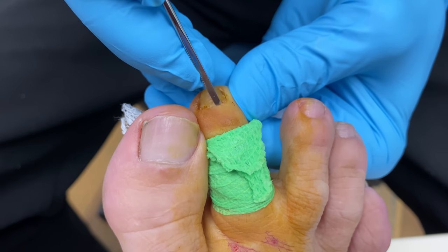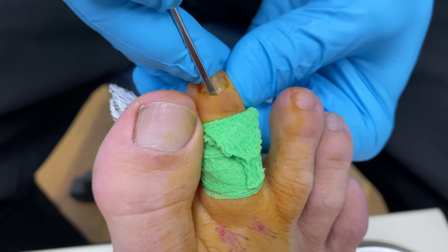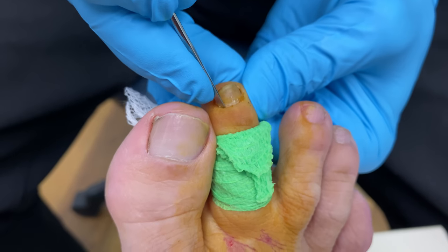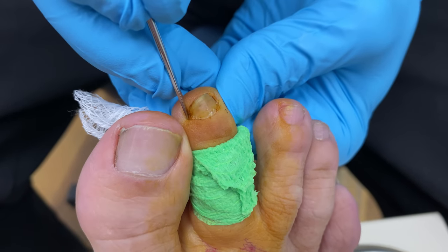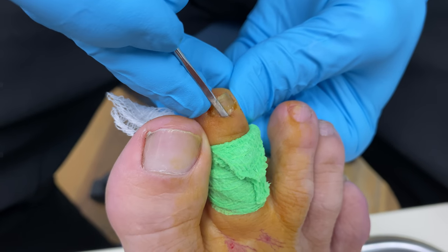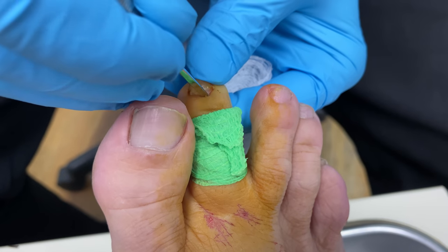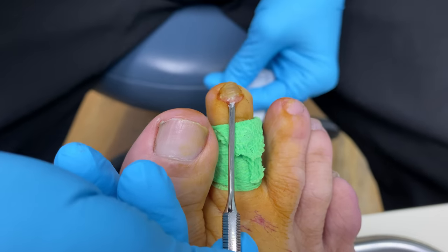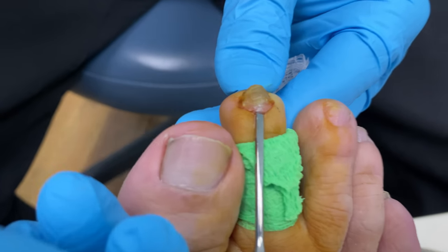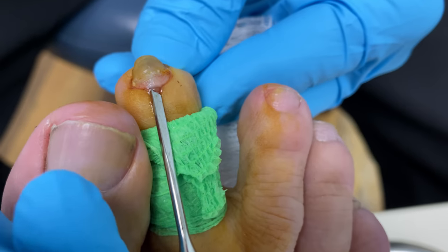So I'm going under the eponychium — that's right here at the cuticle level. And I'm actually pushing against the nail when I do this; this is kind of my guide so I don't go through anything else. And I'm trying to do as little trauma as possible to this nail bed. What works best for me is really the flip — I like doing that back flip because I can back flip it and then I can actually go against the nail itself, not the nail bed. That way I'm doing little trauma to the nail.